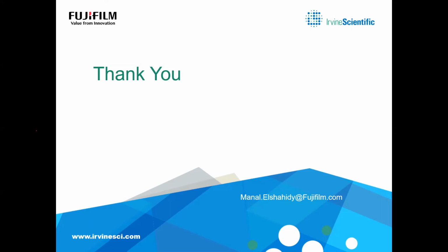If you would like to try two different vitrification media in your lab, the last thing I would like to say is that you really need to look properly at what you use in your lab, because your media tells you what to do for the concentration, the temperature, for everything. The composition of the media decides how you should use it in your lab. That is something important.